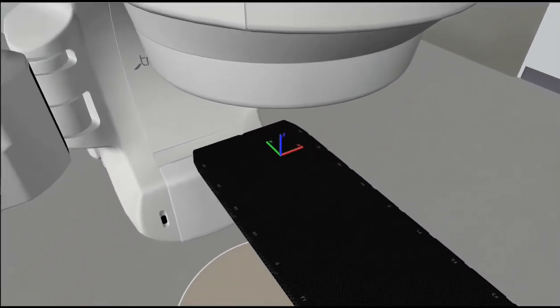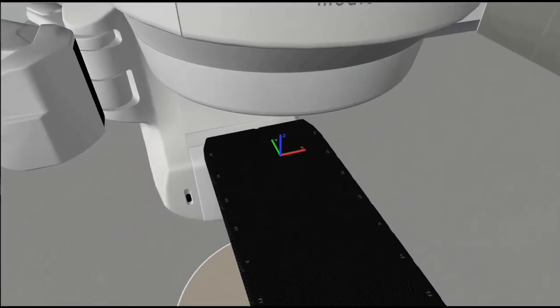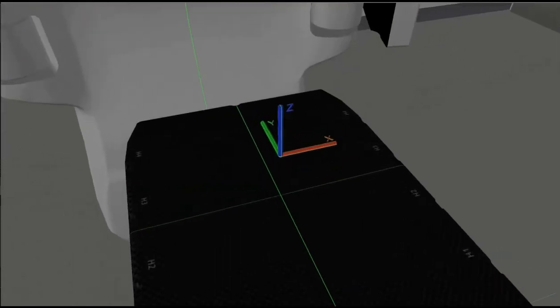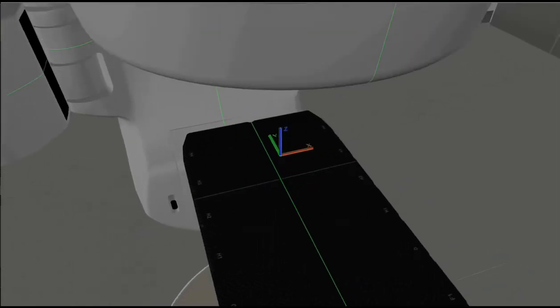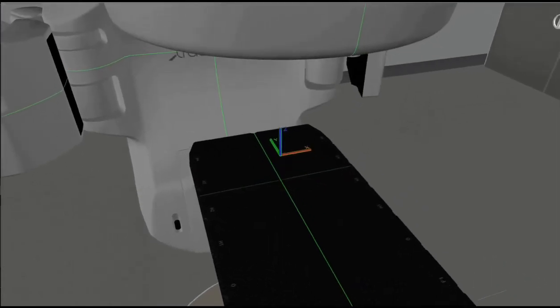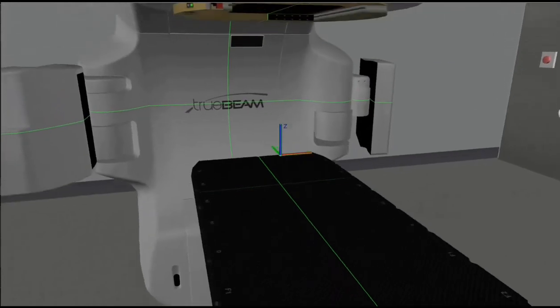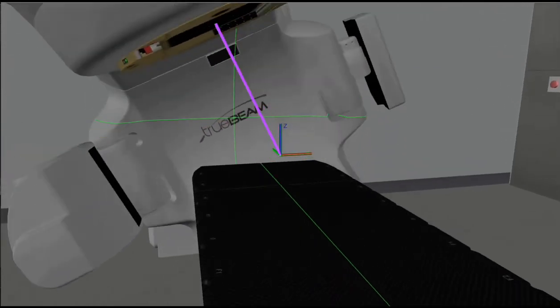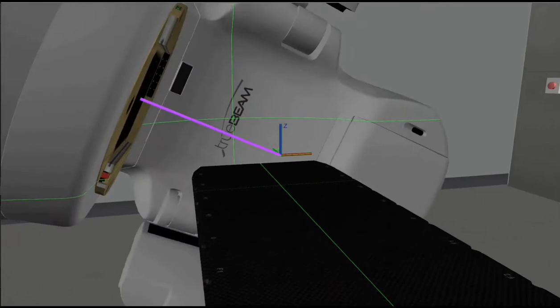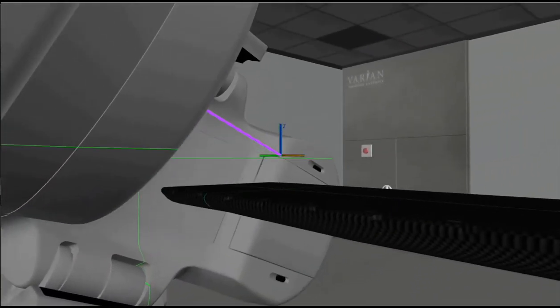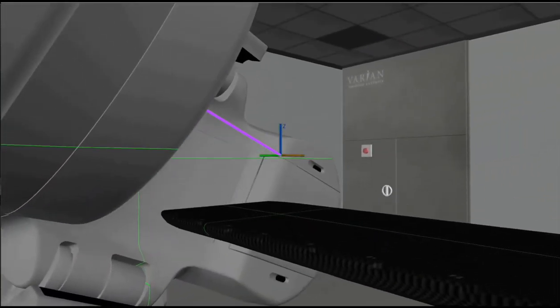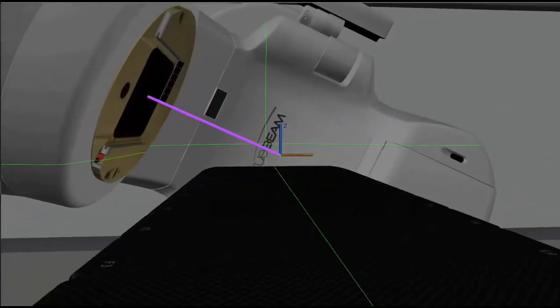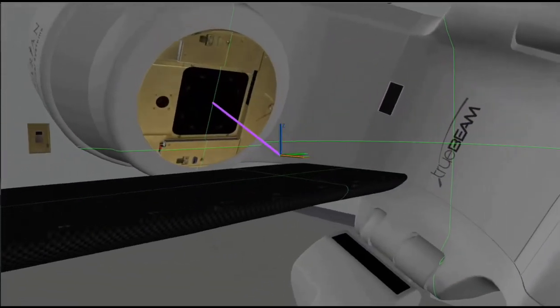One benefit of the system is that you can turn concept into reality. For example, the theoretical concept of the isocentre, which is difficult for many to understand or visualise — the point in air where the lasers meet — can now be seen clearly as the couch and the gantry move around while the isocentre remains fixed.